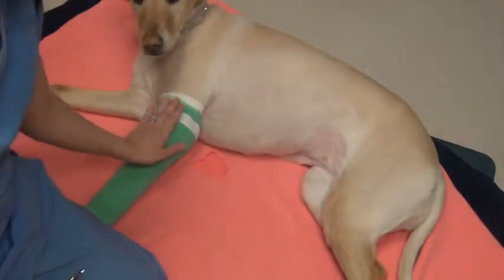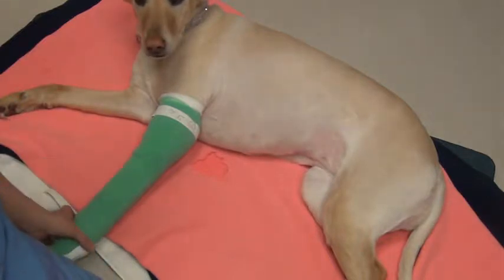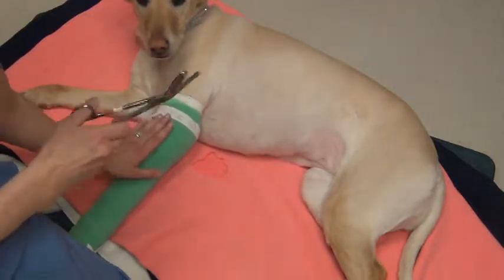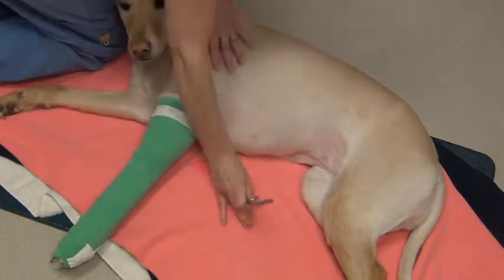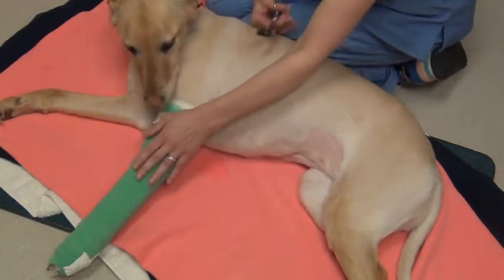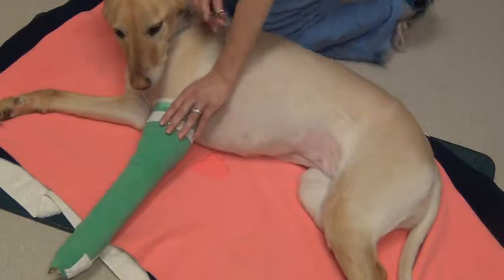Okay, now we're going to go ahead and remove Daisy's Robert Jones bandage. You can unravel these just by hand by taking off each layer, or you can simply use bandage scissors to cut. I'm going to do that. I'm going to go ahead and come up behind her and cut with these scissors. If she had any wounds, I would want to be mindful not to go anywhere near any wounds with scissors. So you've got to get a knowledge of the patient before you take a bandage off.